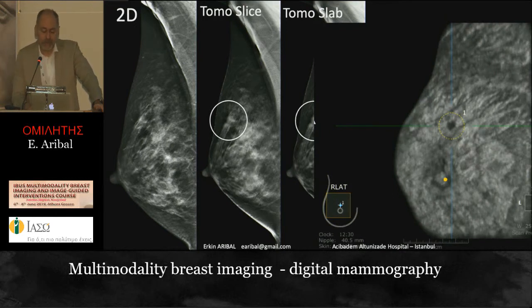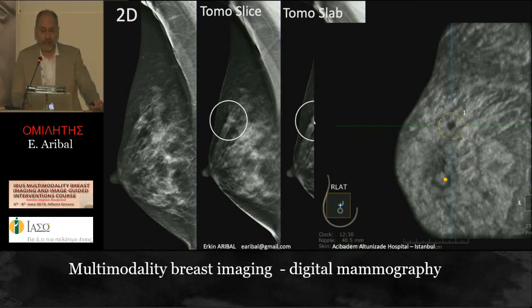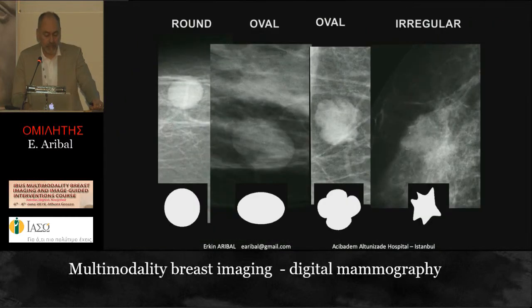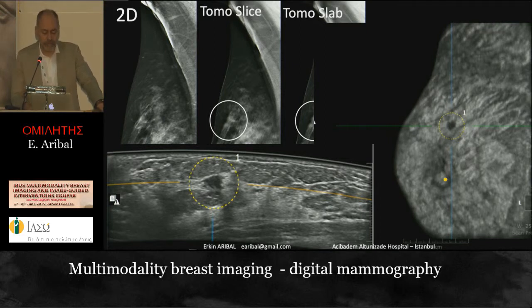Here is another case where you see nothing on the 2D mammogram, but on the tomosynthesis slice you see a spiculated mass at twelve o'clock. The first one is the slice, the other is the slab. Our tomosynthesis slices are 0.5 mm thickness and the slabs are 5 mm thickness. Sometimes slabs help show the structure of masses, and most of the time they show calcifications better, so we search both. Here is the automated ultrasound — for screening and diagnostic purposes we first use automated breast ultrasound because the coronal images give a lot of information.